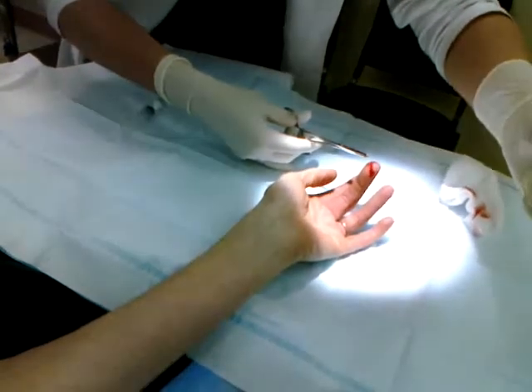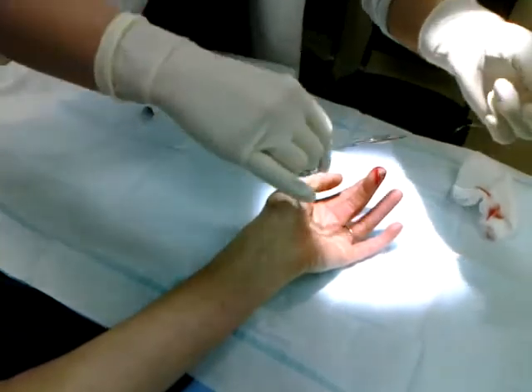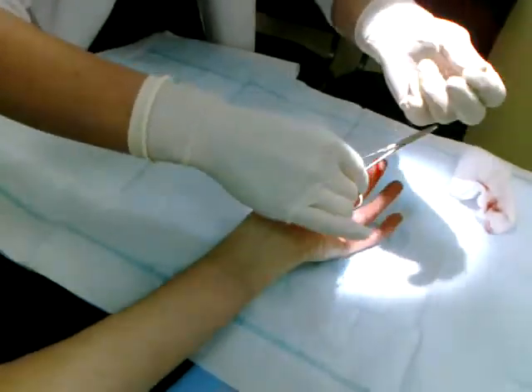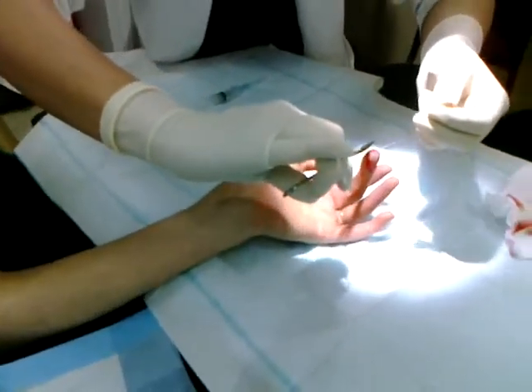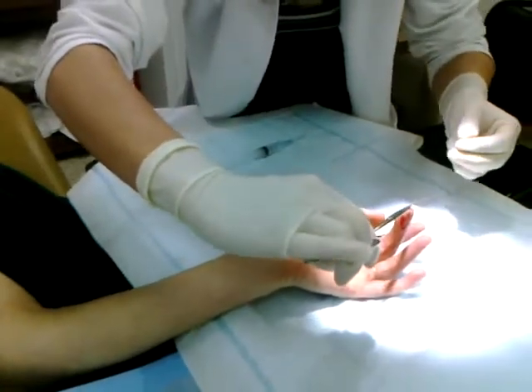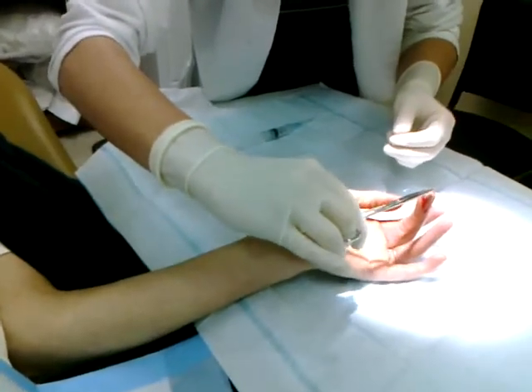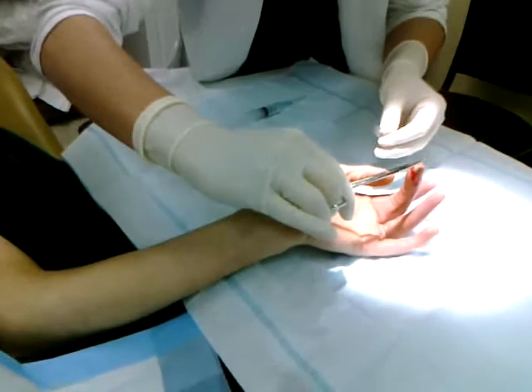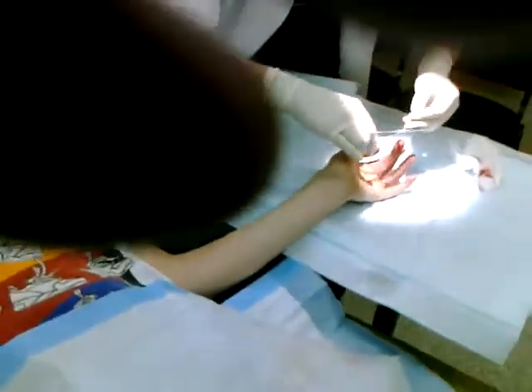As far as the knot itself, it's pretty simple. You wrap the suture line around your tool twice, then grab the tip and pull it through. They're called square knots — doing them individually that way just holds everything better and tighter.